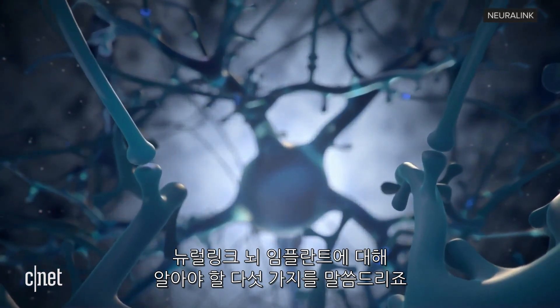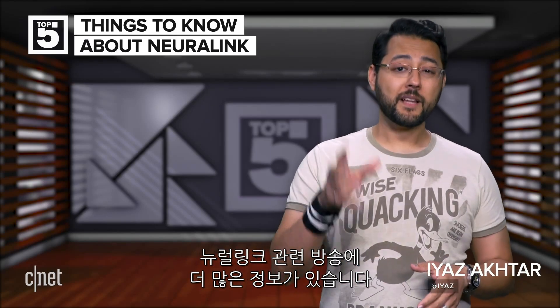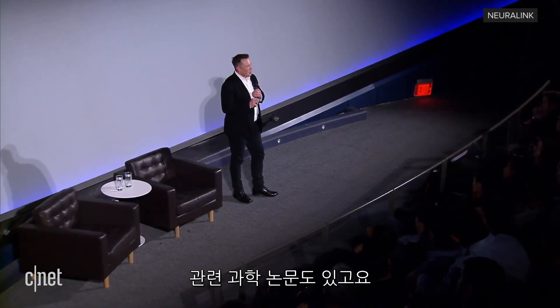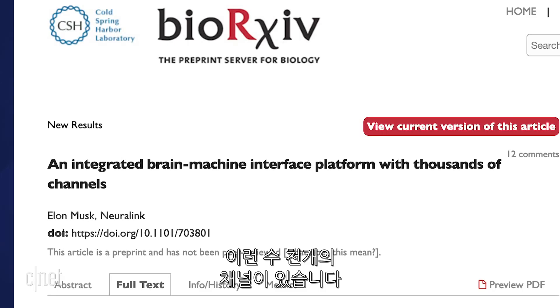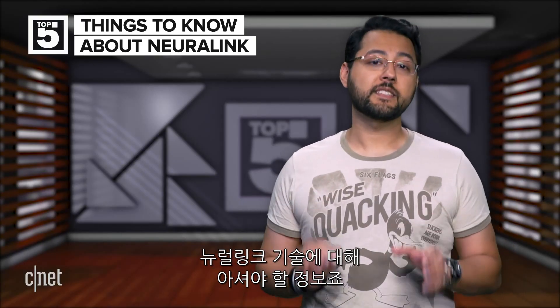These are the top five things you should know about the Neuralink Brain Implant. If you're watching this, you probably know something about the brain implant already, but there was a lot of information in Neuralink's livestream and the related scientific paper entitled 'An Integrated Brain Machine Interface Platform with Thousands of Channels.' I'm going to give you the top five things you should know about Neuralink's tech.